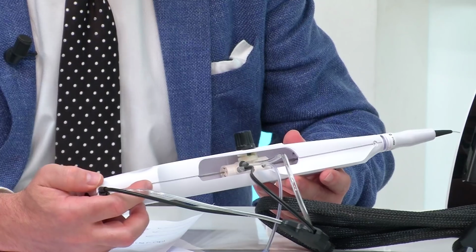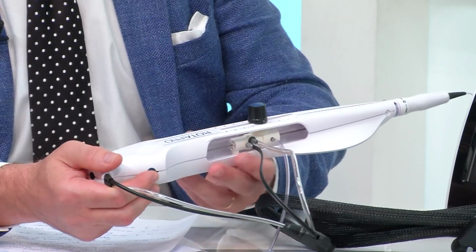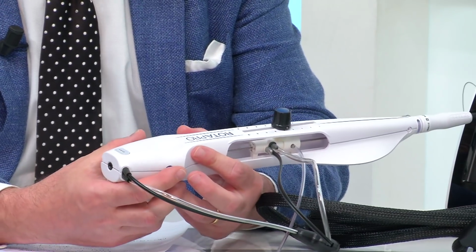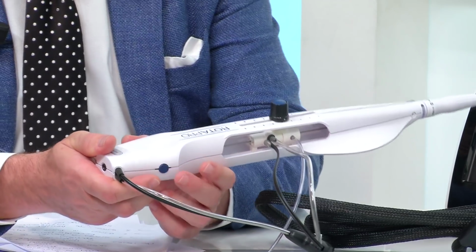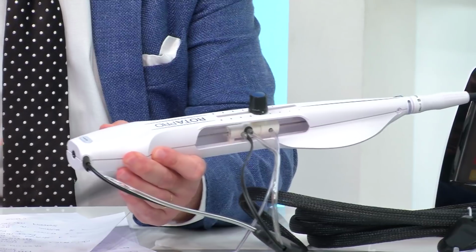And finally, the last button is the one that you will use to perform the DynaGlide. So when you are performing the DynaGlide, simultaneously with your left hand, you will push on the brake, push on the DynaGlide system, and then you will pull back your system and your wire, pushing your wire. So very simple mechanism.